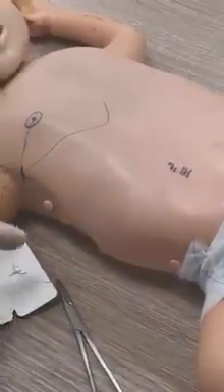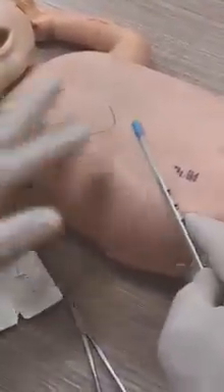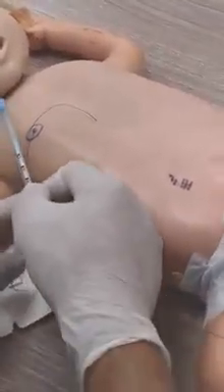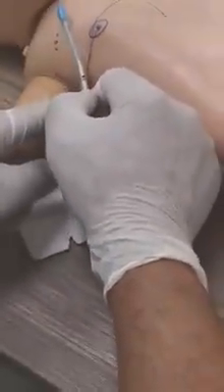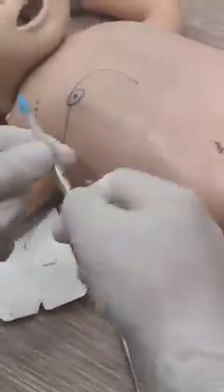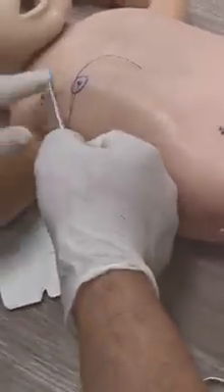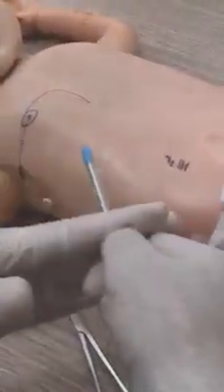So I am measuring by my eye. We know that everything is a trial initially. Suppose the direction should be up to the apex of the lung. If I go from here, this will be very acceptable for me. This will be very nice. So I am holding the tube from here like this. So we measure like this. Even if I pass, the end will be here.